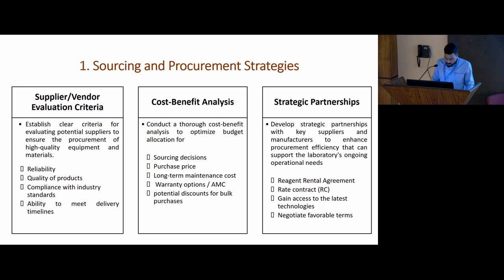In our setup, we have a reagent rental contract with the vendor, and you can do this kind of thing also. You don't need to purchase the instrument, you only have to purchase the reagents and they provide the instrument. So it's a win-win situation for both of them.